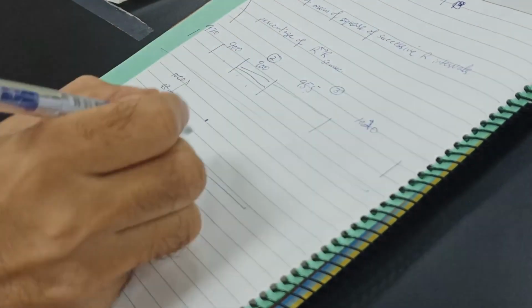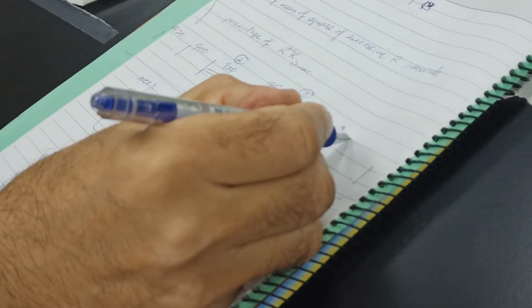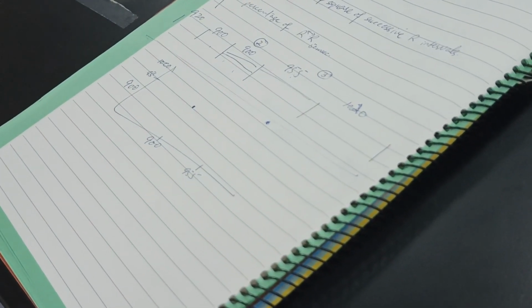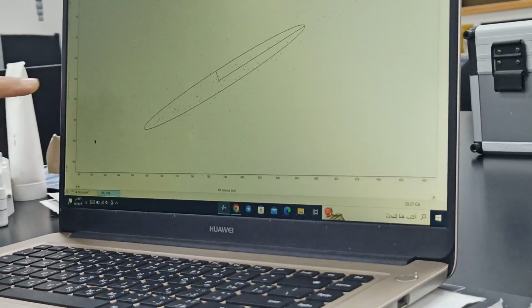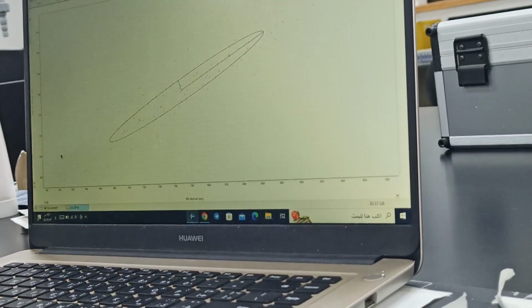The next one is 955. Now it will be here. And further is 1020. So that will be here. So it's written next RR interval. We are plotting every RR interval with the next one. So this is the whole scatter of the data.